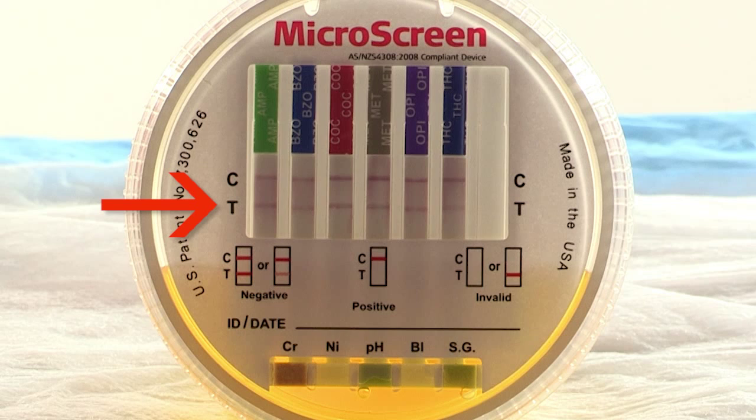Now in this case, we have all the lines appearing in the C zone, but we also have all the lines appearing in the T zones. So this sample we interpret as being negative for all of the classes of drugs we are testing for.